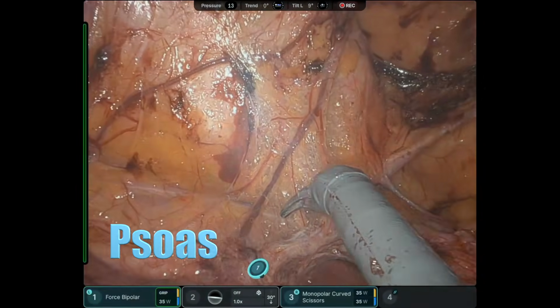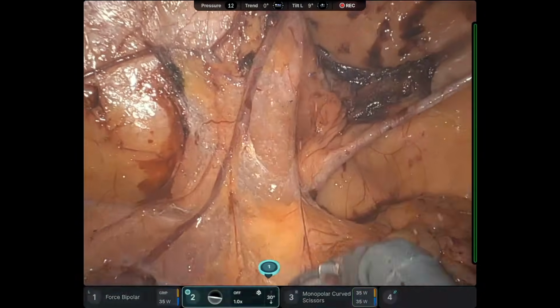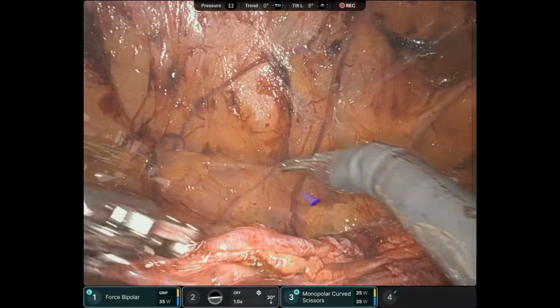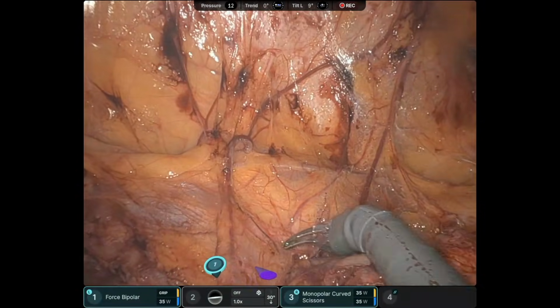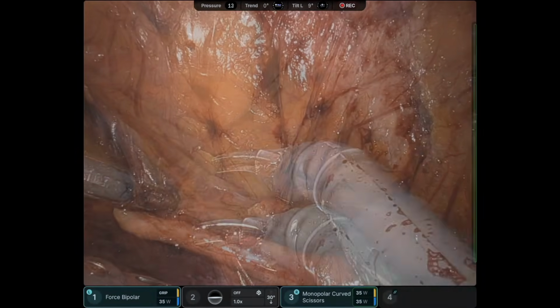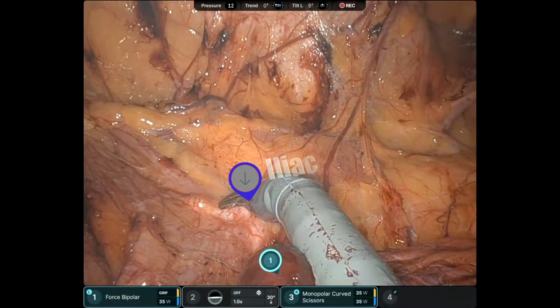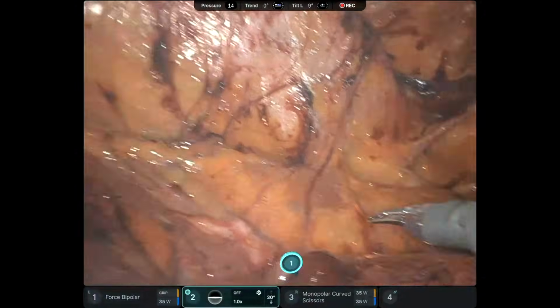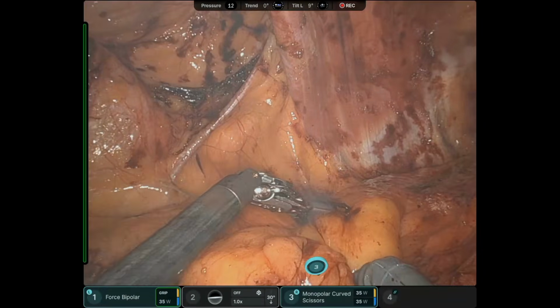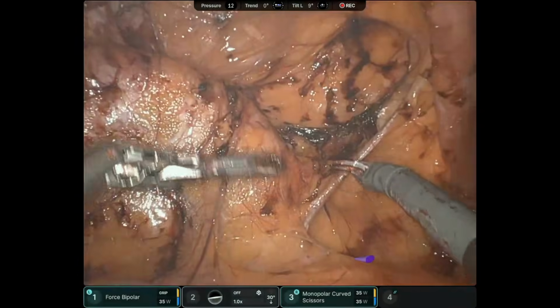Familiar with that area, doing inguinal hernia repair. There's the psoas. There's the ureter, medial border psoas. And you can see I'm just dissecting carefully at top of psoas muscle, trying to leave transversalis fascia on top of that. You can see cord structures there, the vessels, gonadal vessels. Here's the iliac vessel. So I'm pretty happy that I'm down to the medial border of psoas there. Just making sure my cephalad retroperitoneal overlap is adequate as well.